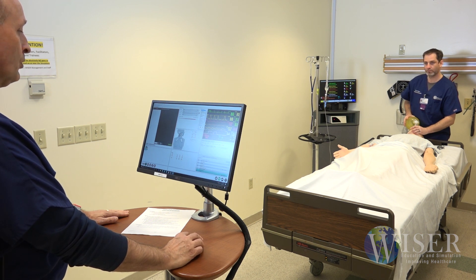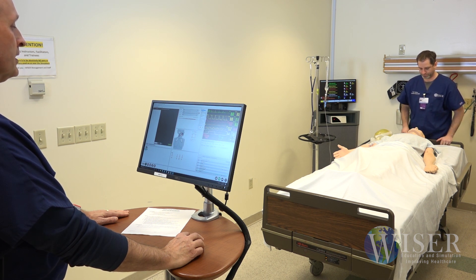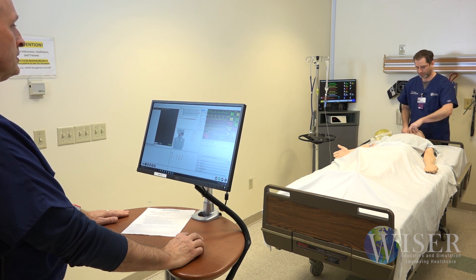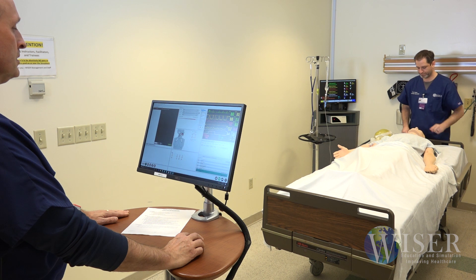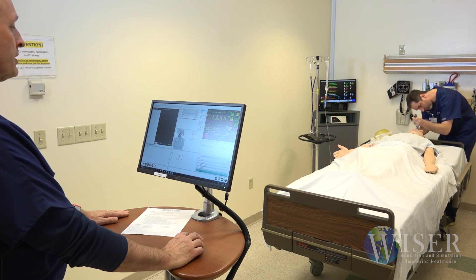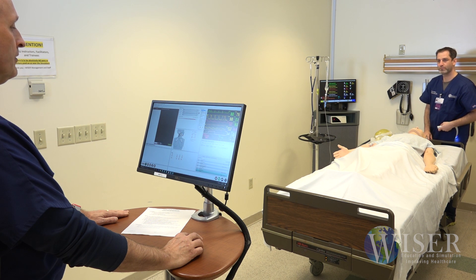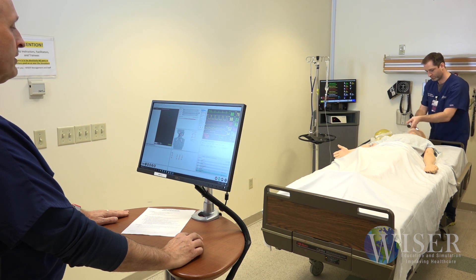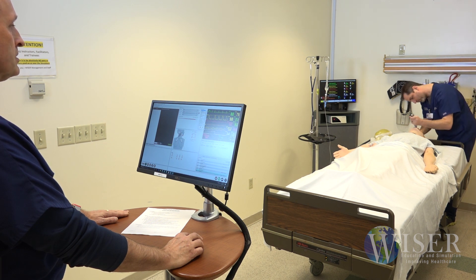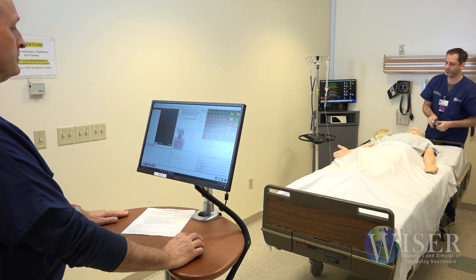We then test the airway. We test trismus, tongue edema, and cervical range. After those are confirmed, we go ahead and test pharyngeal obstruction and laryngospasm, each confirmed by the partner.